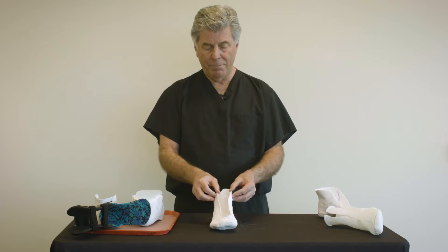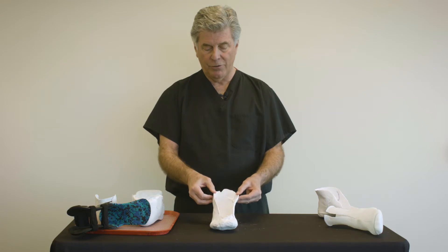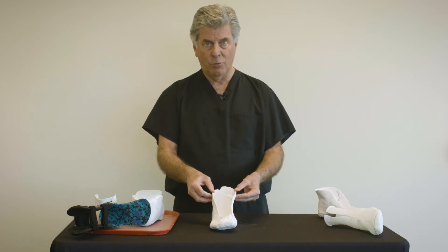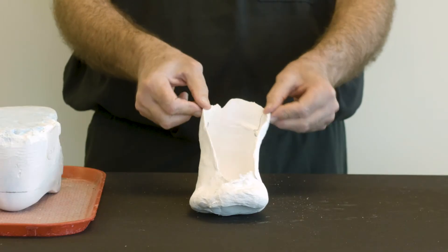Now the upper part of the cast is flimsy, allowing three centimeters of excursion either in or out, and the lab has no idea where the true width of this patient's ankle bones truly are.